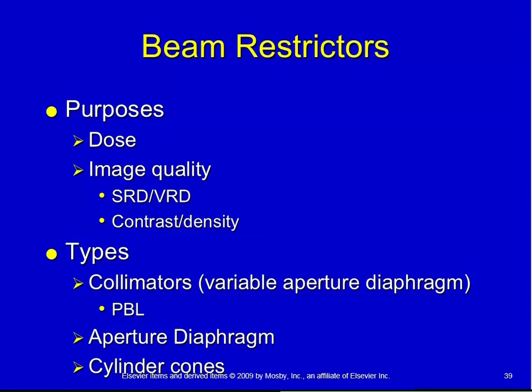Now we're getting into what you might want to equate with tissue thickness, density, and beam restriction. We prevent some scatter from being created whenever we beam restrict. Since we prevent that scatter from being created, we prevent what would be created from penetrating through and exposing the image receptor, and therefore we lose density. So going back to our explanation of the way the phototimers work, can the phototimer differentiate between penetration and scatter? And the answer is no. So if our phototimers are set to create a density in an image based on how much is penetrated through the patient, that scatter is accounted for in that number. So if you collimate, you're going to remove some of those numbers. And removing some of those numbers, if your mass is not adjusted, then your density comes out too light.